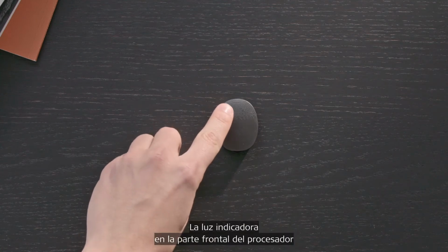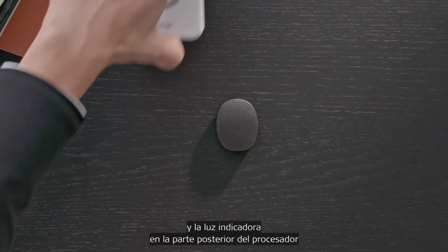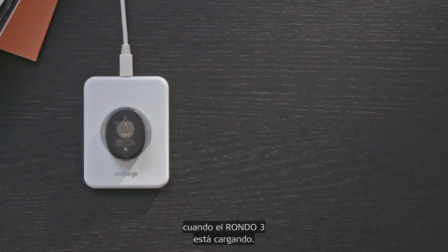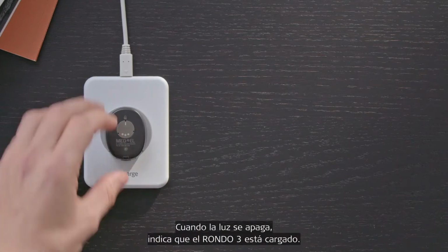The indicator light on the front of the processor is the main indicator light, and the indicator light on the back of the processor is the charging indicator light. The charging indicator light glows orange when Rondo 3 is charging. When the light goes off, Rondo 3 is charged.